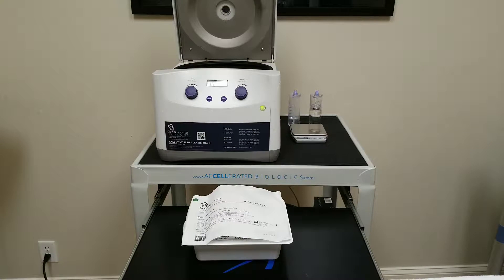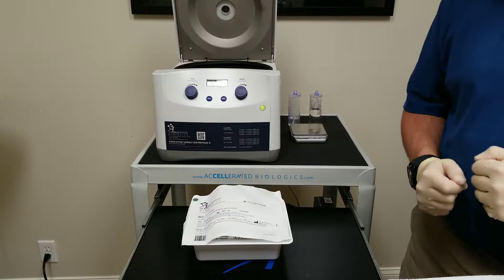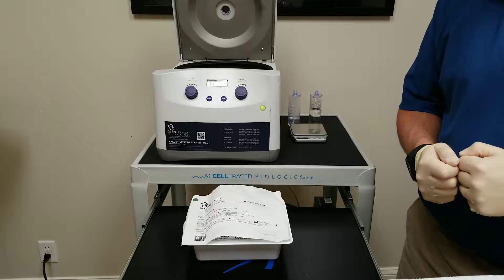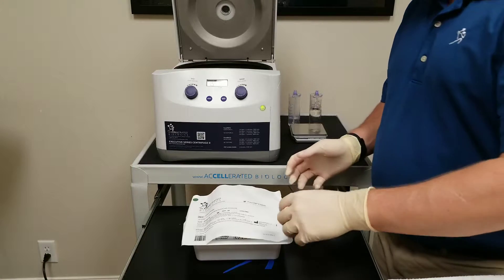Hello, this is Felix Dunn with Accelerated Biologics and I'm going to go over the AB60 Pure kit. It is the M-Sites Pure PRP 60 ml PRP processing kit.